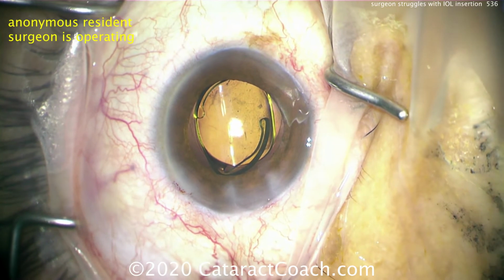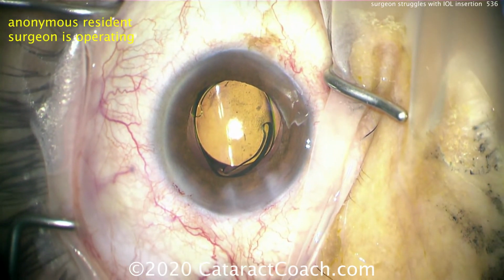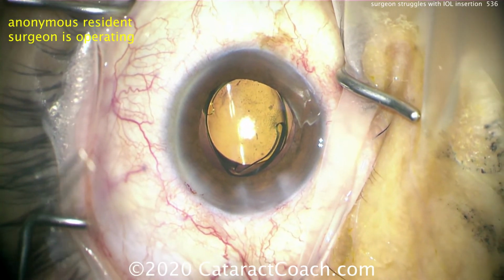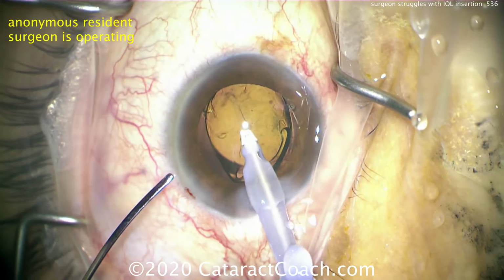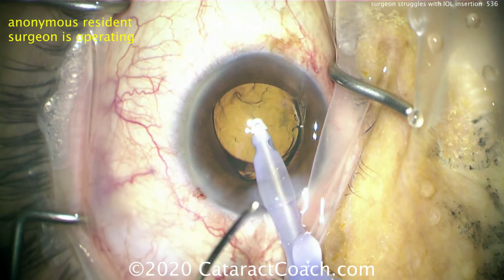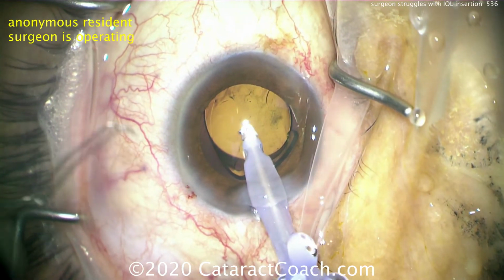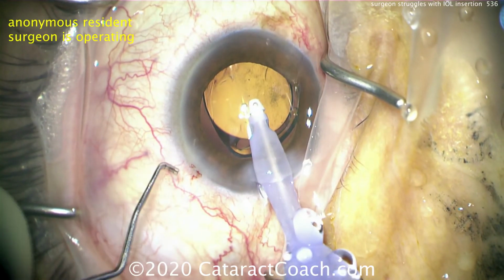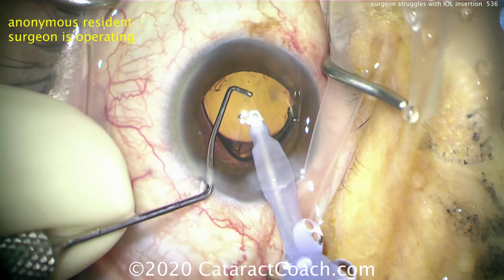And that's a problem because the haptics, they're not unfolded just yet. So the mistake was the way the resident manipulated with the chopper or second instrument allowed the AC to collapse and all the viscoelastic to escape. So here now using the IA probe to expand the capsular bag, deepen the AC, pressurize the eye, now using the second hand to try to get this lens positioned.